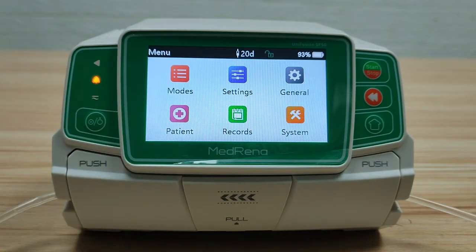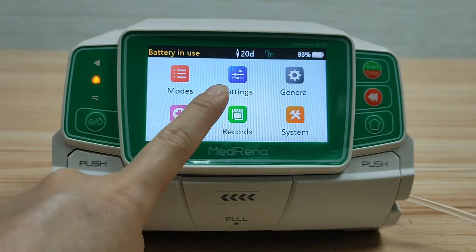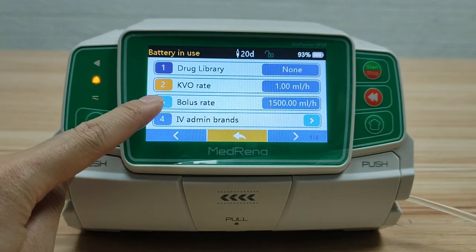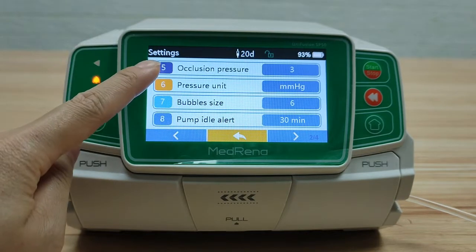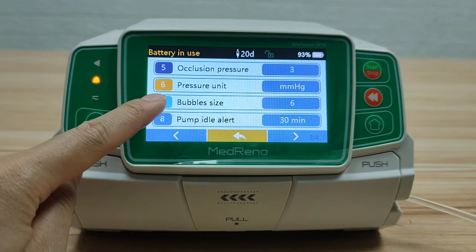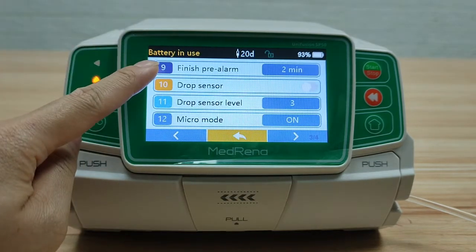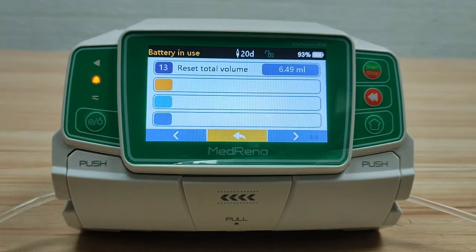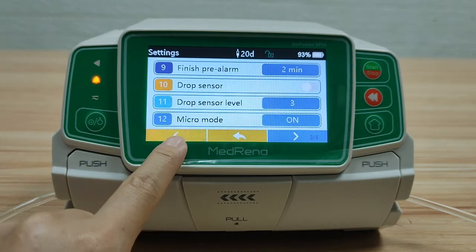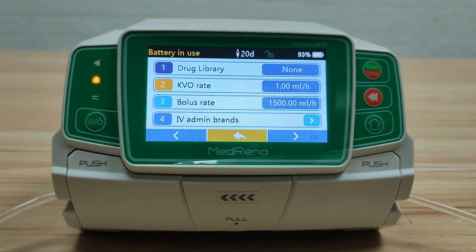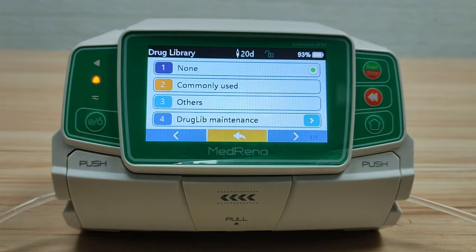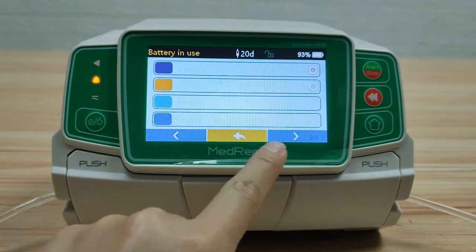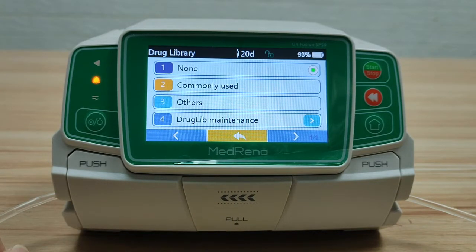Next, let's look at the other boxes one by one. Under Settings, we have: preset drug library, KVO rate, bolus rate, IV brands, occlusion pressure, pressure unit, bubble size, pump idle alert, finish pre-alarm, drop sensor, drop sensor level, micro mode, and reset total volume.